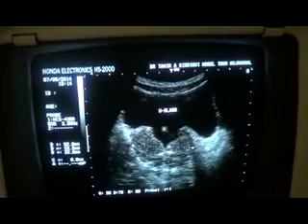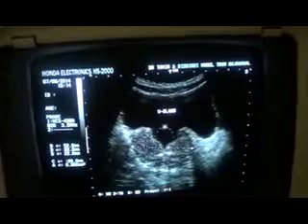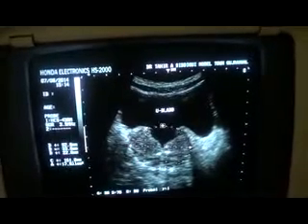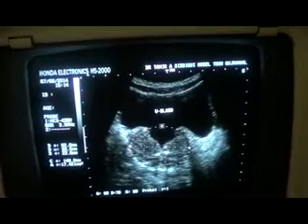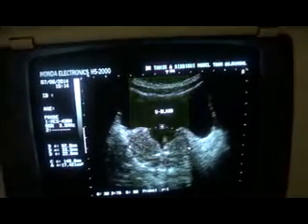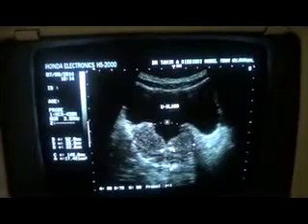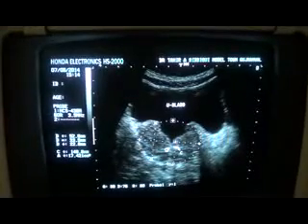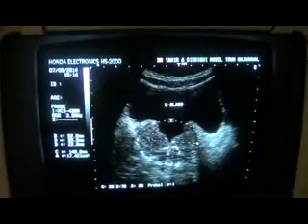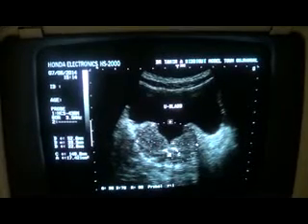This is the prostatic fossa, and it is full of heterogeneous mass with internal tiny echogenic calcifications. Multiple calcifications are seen. Posterior shadow can be seen from this echogenic area. So in this view, we can see two tiny echogenic areas.